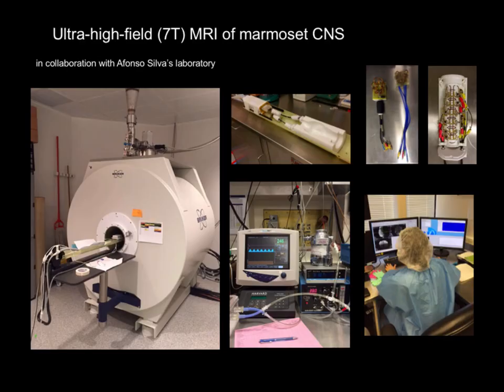So what we did basically has been to update this approach using more modern scanners. Dr. Silva provided access to a scanner and resources and staff, and we've been able to really beef up our imaging on this animal. And we have an array of coils that have been built in Alfonso's lab, a head coil and a spinal cord coil. And we have all the tools that we need to monitor these animals while they're being anesthetized and scanned for hours and hours.